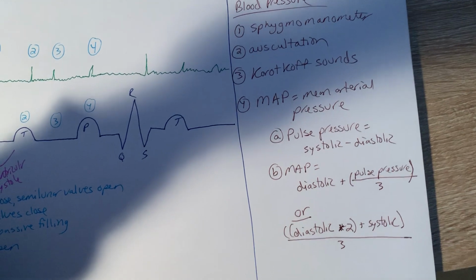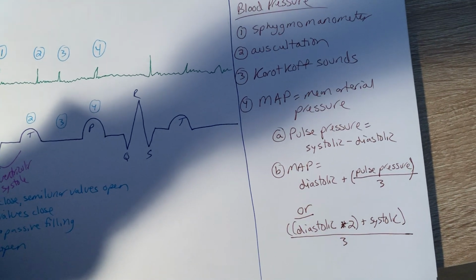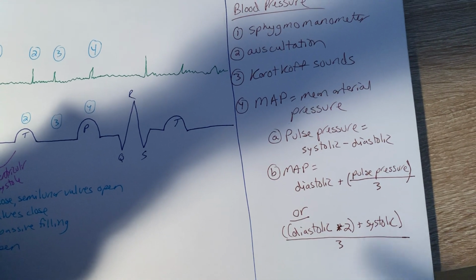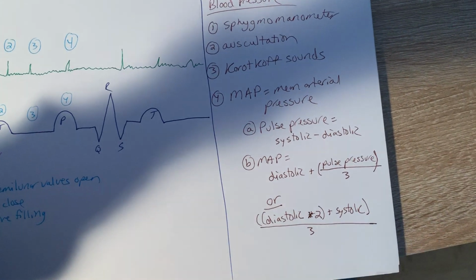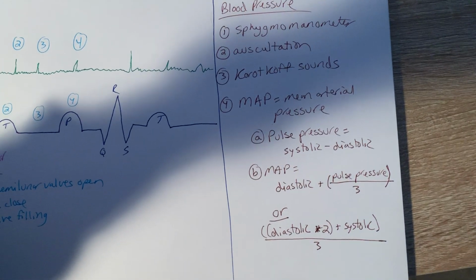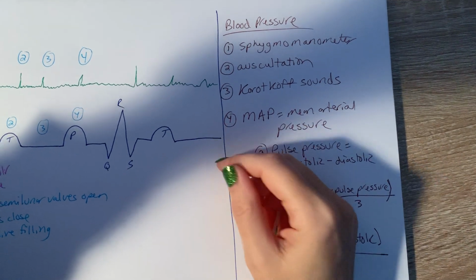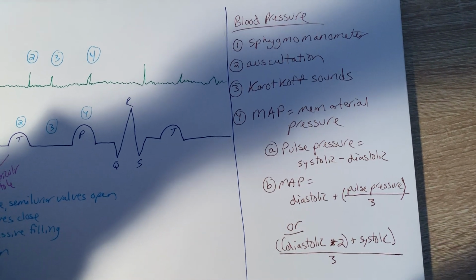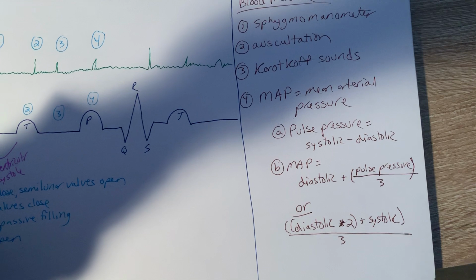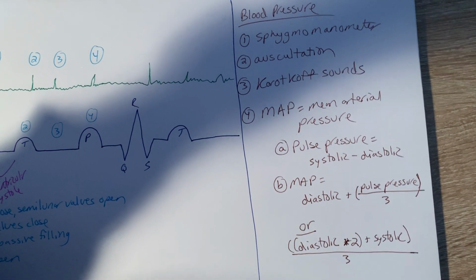And that's the turbulent flow from the blood that's been backed up behind that blood pressure cuff being allowed now to go down through your brachial artery. And it makes a sound because it's going to be rolling, more of a turbulent flow than a smooth flow. And it begins at the highest pressure. You'll start to hear this little click, click, click sound, or a little whooshing sound. It's a very soft sound. And this is what you would be using the stethoscope for.